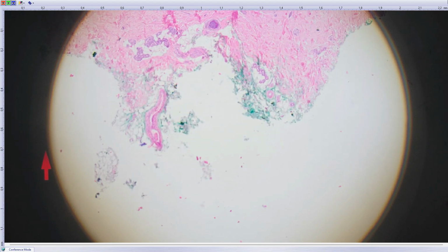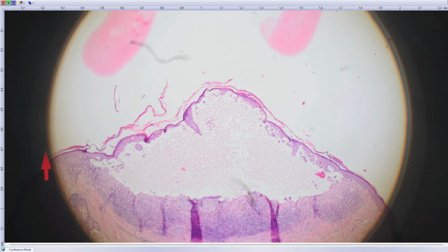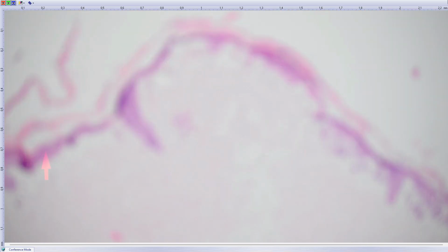I believe in immunohistochemistry with PLAG1. I do not believe so much in immunohistochemistry with HMGA2, that's non-specific. But PLAG1 seems to be quite good for pleomorphic adenomas and myoepitheliomas. The previous case, Michal, I think it was simply an oncocytic type of benign myoepithelioma with PLAG1 fusion. Yeah, we have such cases. That's not so rare.